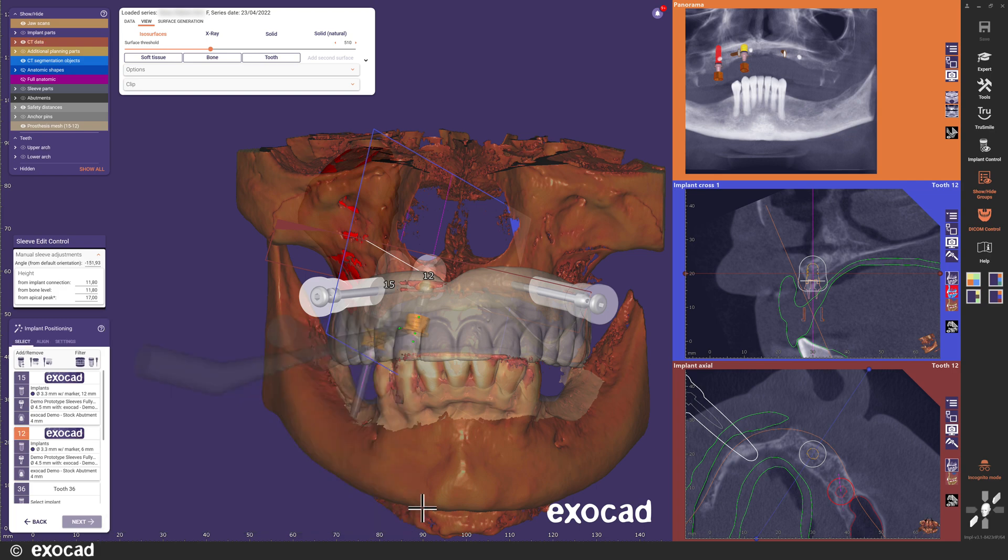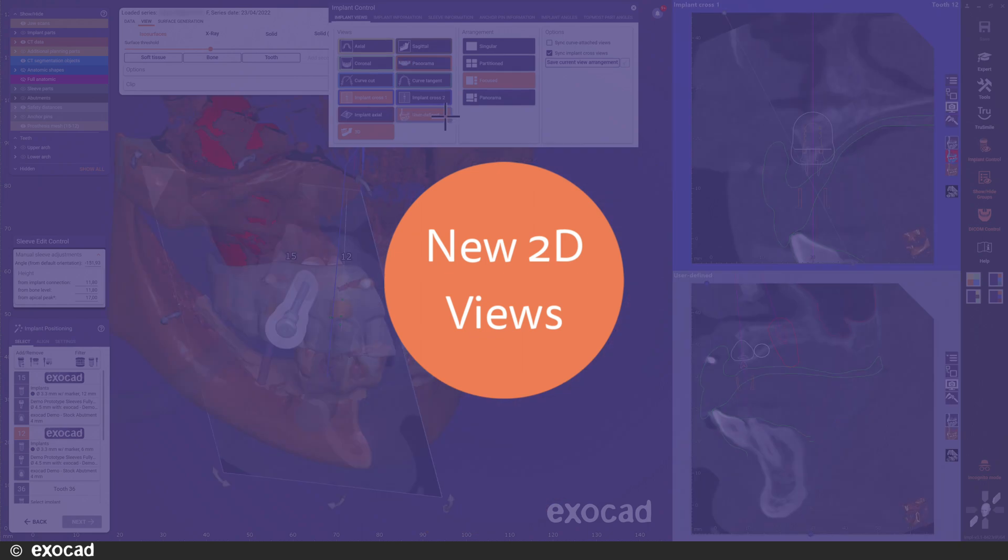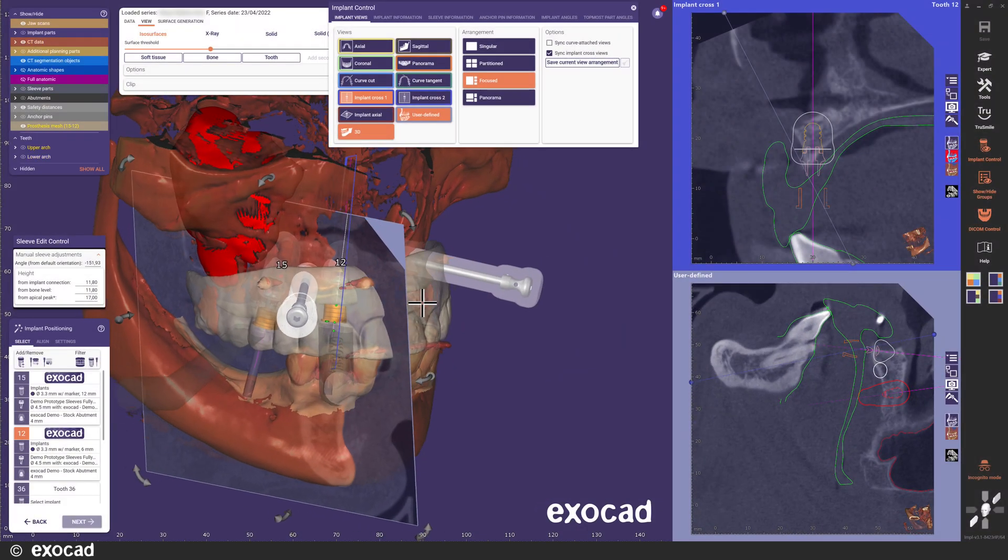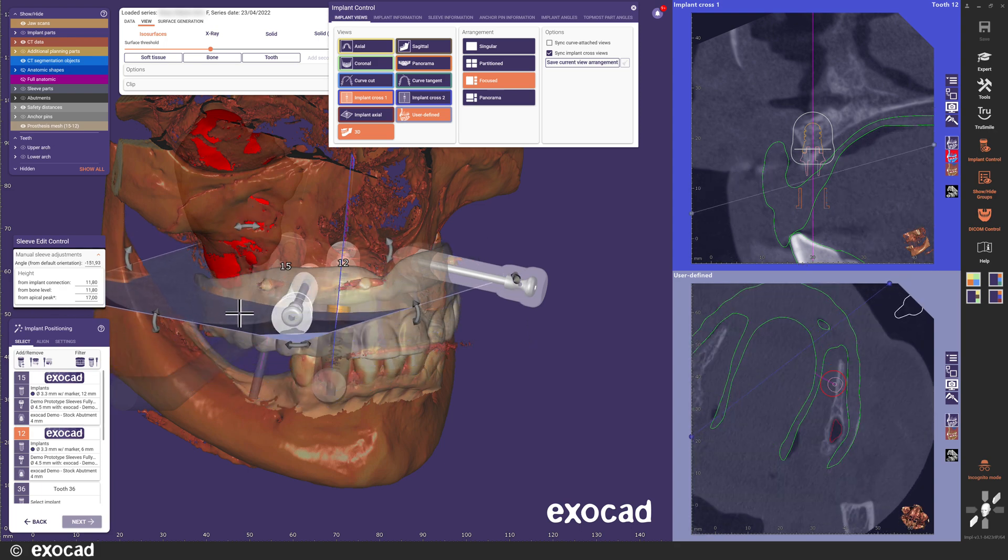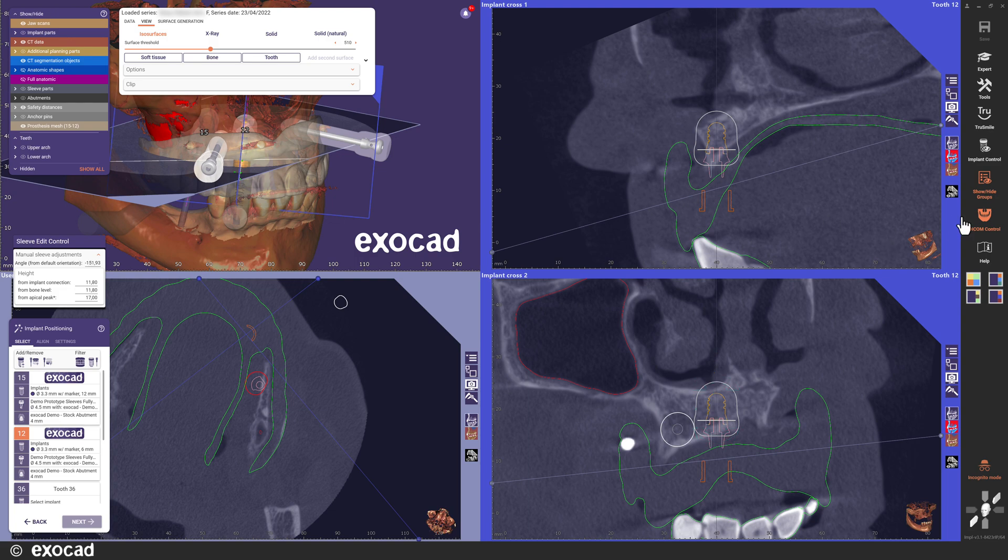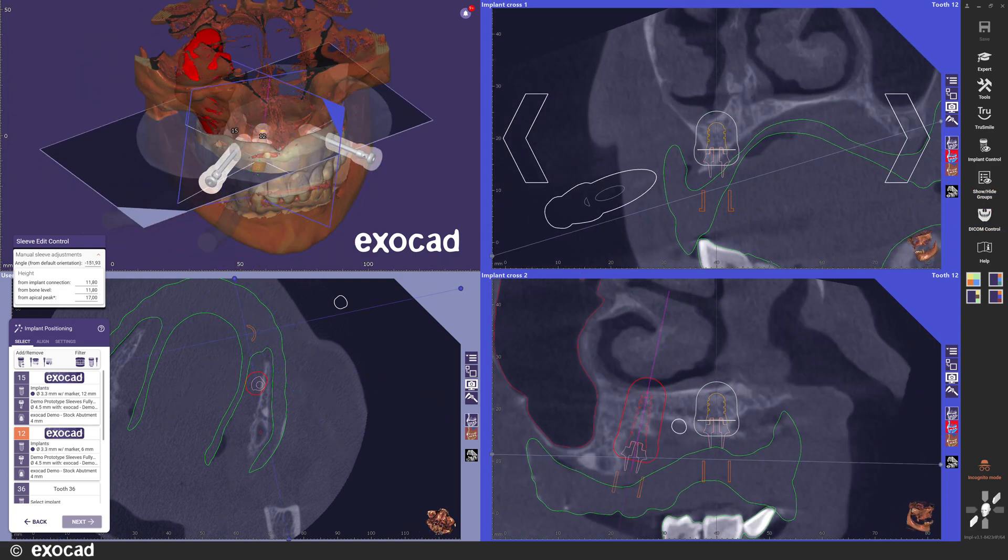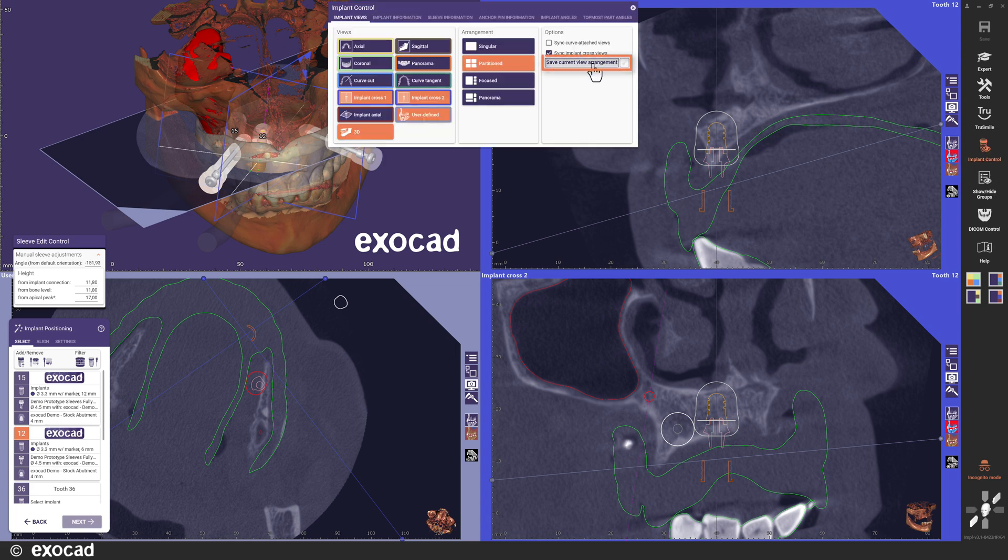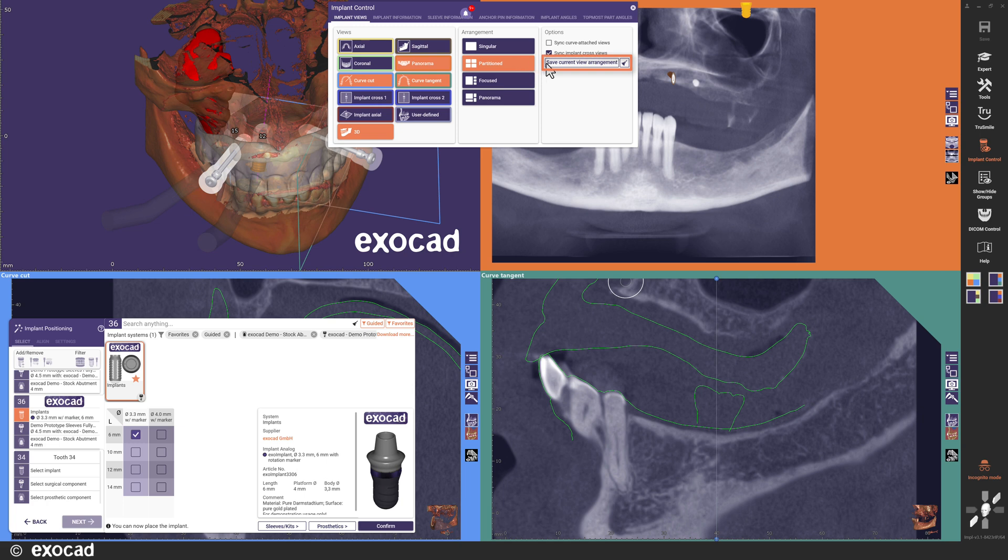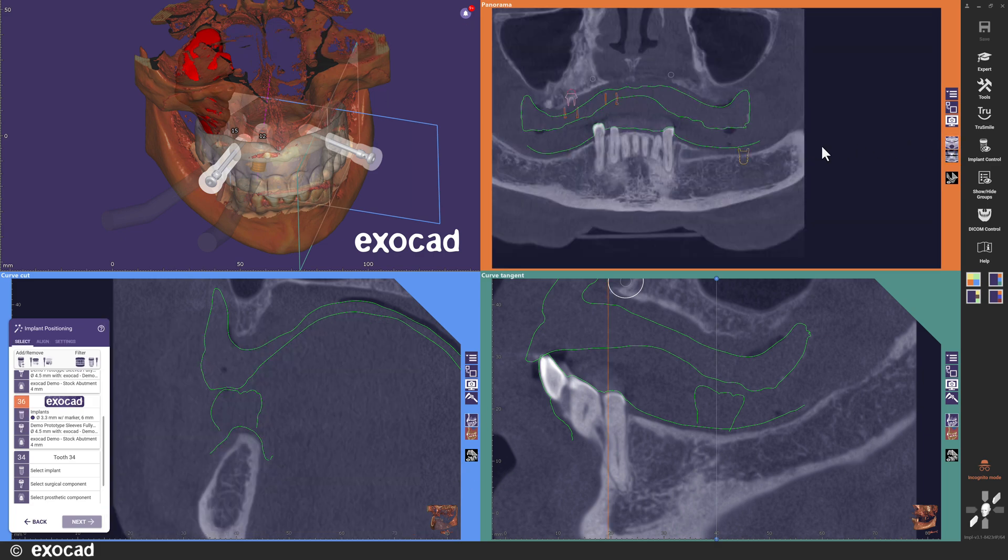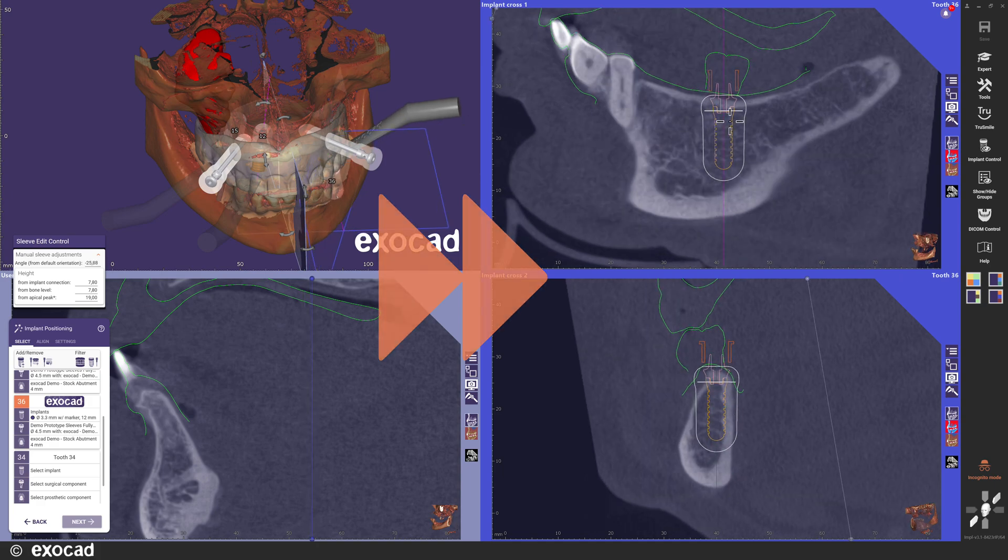Let's have a look under the implant control again. We have added two new 2D views. One user defined 2D view which you can place wherever you want. And the second implant cross view to complement the first implant cross view. We also made the 3D view optional for those of you who prefer to only work with the 2D views opened. As mentioned earlier in this video, you can now save your preferred view arrangement for each step. In the implant positioning step, you can actually save two view arrangements. One for before the implant is placed and one for when you adjust the placement. Let's place the implants for the lower jaw as well and continue.